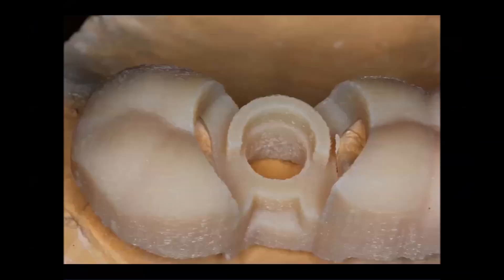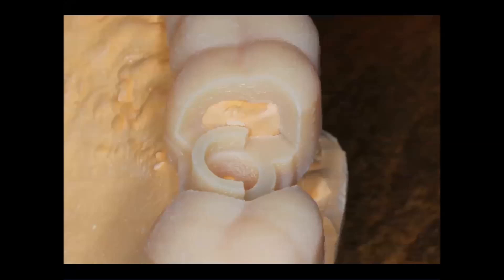The handpiece will bottom out on this and that will be the extent of our osteotomy depth. Once the guide has been designed, it's exported out of the software and uploaded to any number of labs to be 3D printed. Here you can see the 3D printed guide being tried back onto the stone model and we're verifying that it has a very accurate fit. You'll notice the windows that are cut out around the teeth, which allow me to verify complete seating against the model — and you should take great care to make sure that it's seating the exact same way inside the patient's mouth.